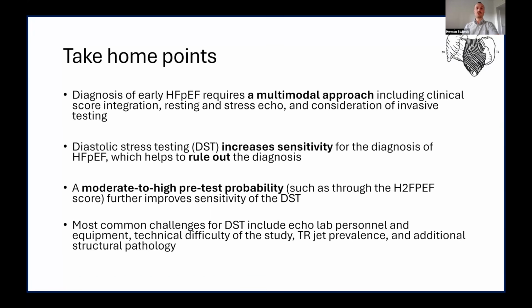And the most common challenges for diastolic stress testing include having trained echo lab personnel and equipment. There is also the technical difficulty of the study and being mindful of the order of parameters that must be taken. Also, TR jet prevalence is a big challenge, and additional structural pathology can make the diastolic stress test non-diagnostic.